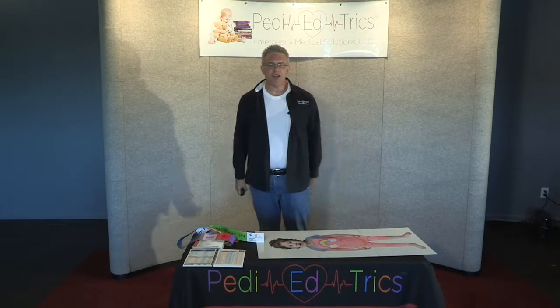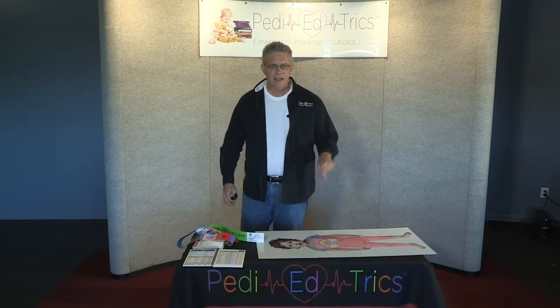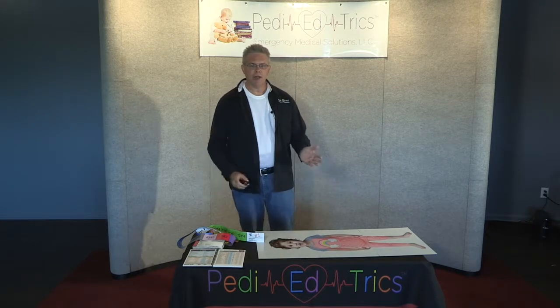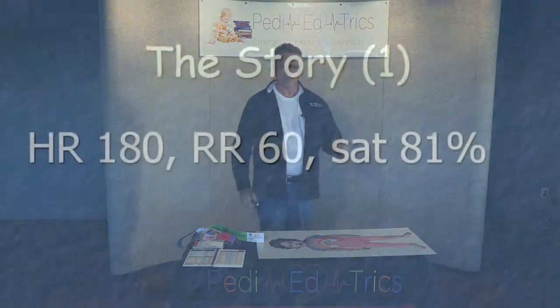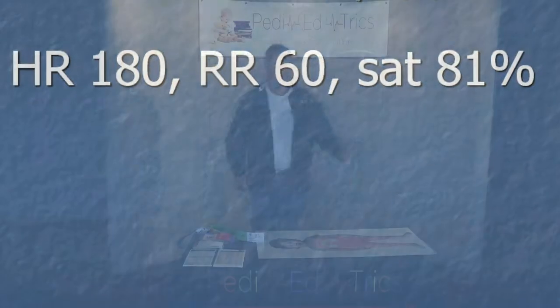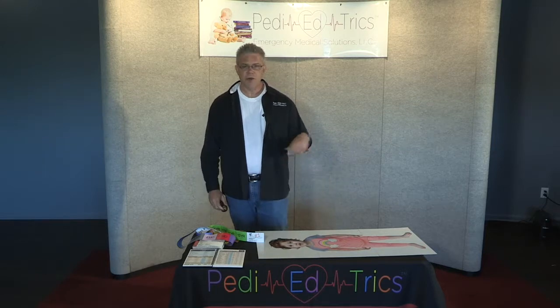So our first scenario is going to be a 14-month-old with failure to fly. Falls out of a 3-story window, getting bagged by the medics. Vitals, as you see, with an ETA of 4 minutes. Which means, realistically, you have about 3.5 minutes to get ready until this little pediatric trauma kid hits your door.